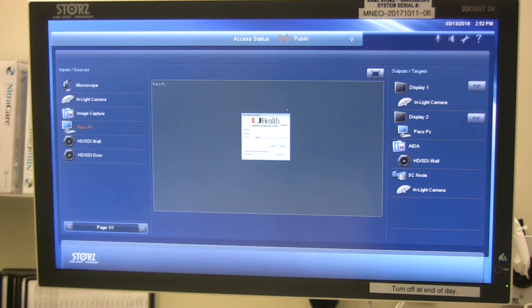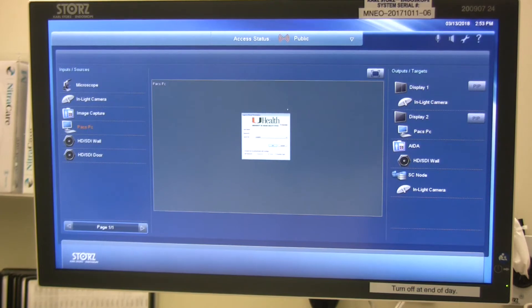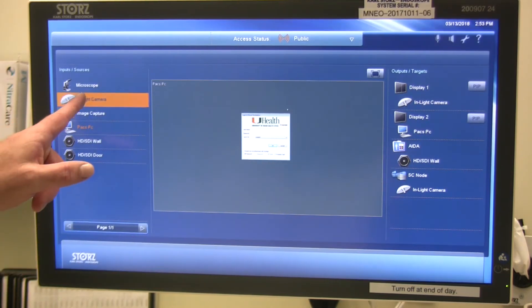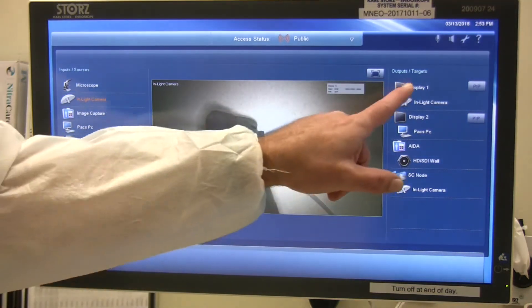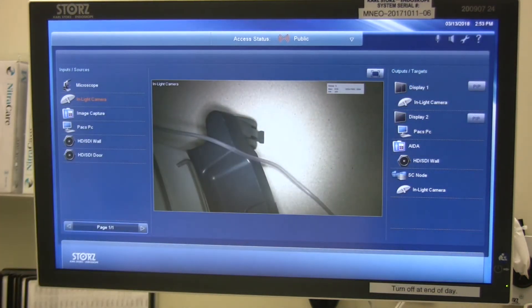At the front in the nurse charge area, there's a large display that has a view of all 10 operating rooms. The view shown on that display is whatever source is selected in the room that is routed to Display 1, which we consider the procedural display.